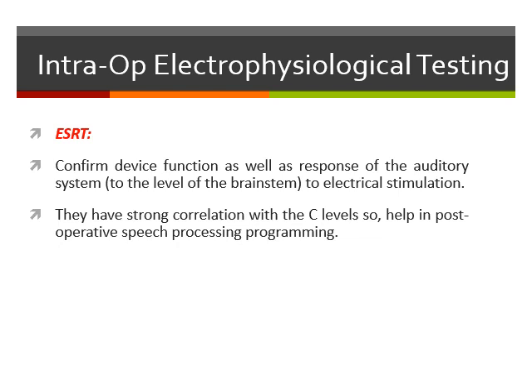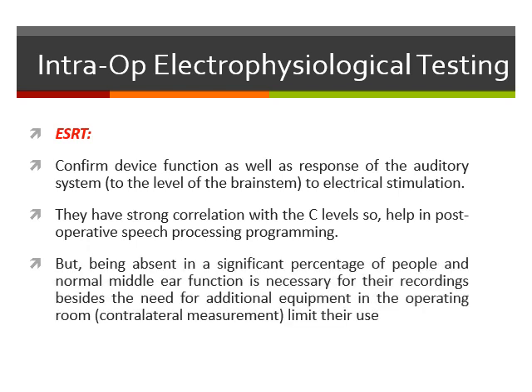Also, it has a strong correlation with the comfortable level, or the C level, but it is absent in a significant percentage of people, and normal ear function is necessary for the recording. Usually, the electrical stapedial reflex testing depends on my visual observation of the stapedial muscle contraction and of the stapes movement.